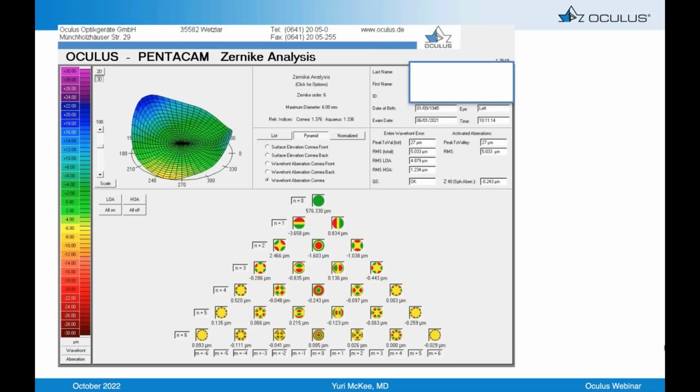If you look a little deeper than the surface, placido disc topography, you're going to find a lot of reasons why people would be unhappy. And half of these patients that we see who are unhappy after prior cataract surgery who have these multifocal lenses placed had very clearly identifiable problems before surgery that meant they should have never had it placed. And that's very hard to explain to someone without bad-mouthing the referring surgeon. I don't want to bad-mouth any referring surgeons, but I do point out, yes, this coma is the reason you're not seeing well, and it's never going to see well with a multifocal lens under it.